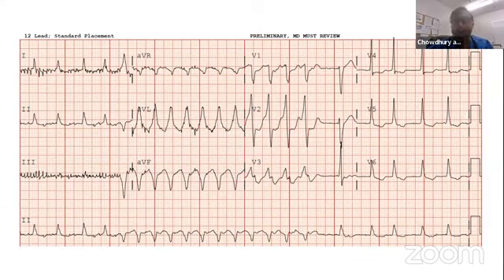No. So absolutely, let me answer, because I work with the residents and the fellows and I understand the problem. First, identify what this QRS widening and tachycardia episode is. What the underlying cause is, that is a different story. But find out what's happening here. Is it a ventricular tachycardia, or what is the differential of wide complex tachycardia? Just go through that rule. I'm sure Rafiq Bhai is going to give you a differential right now, but then find out the underlying etiology. You cannot just jump by looking at the EKG and say this is metabolic. Go by the rule book, the methodology: what is this rhythm first? What is happening here? Rafiq Bhai.